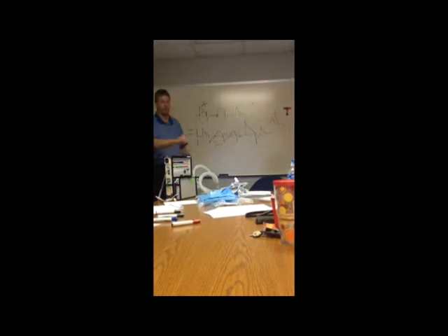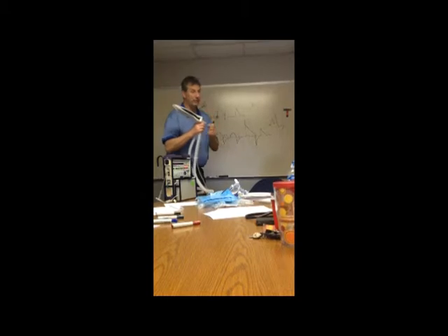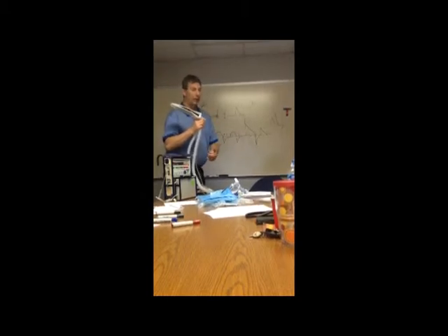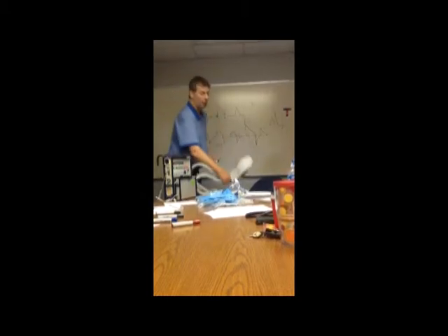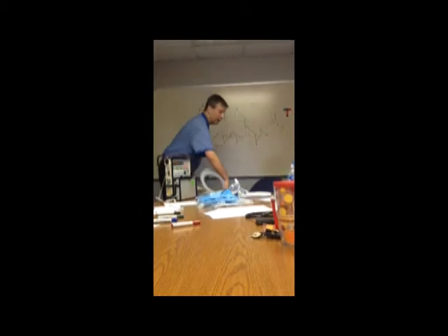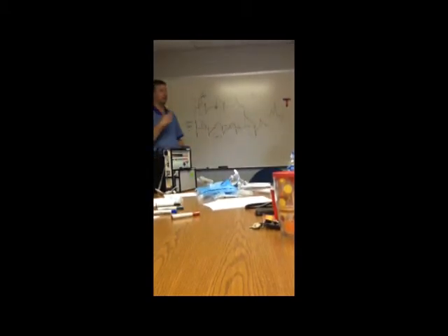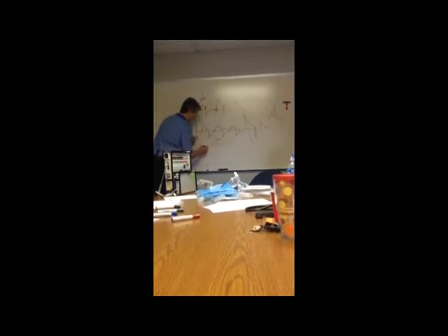just so they get some air, enough to overcome breathing through the circuit, through the tube, because if there was no support through this, it's hard work breathing through an ET tube and breathing through a vent circuit. There's a lot of resistance to the air. So when we do use this, we dial in a little bit of pressure support. Pressure support doesn't tell them when to start or when to stop, so it's still spontaneous, but it helps them breathe more.